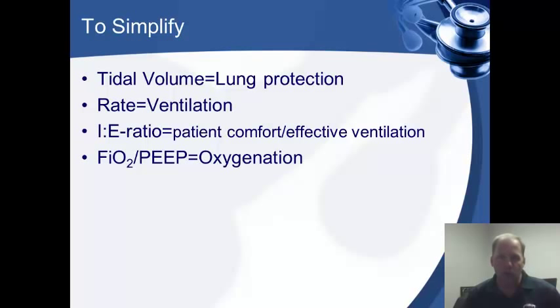Now, if you run into oxygenation problems due to ARDS, maybe a near drowning, some other type of fluid infiltration into the pulmonary system, then you may want to increase your FiO2. As you do that, you're going to want to increase the PEEP very gradually, watching blood pressure very closely, and work those two together to increase oxygenation.